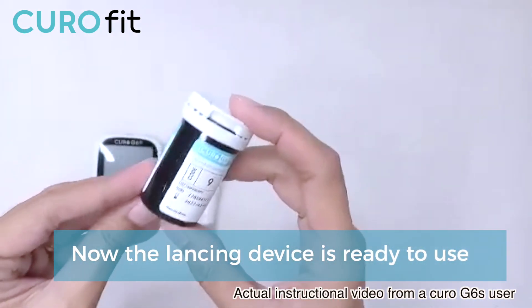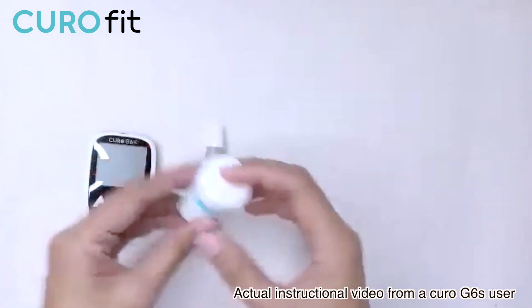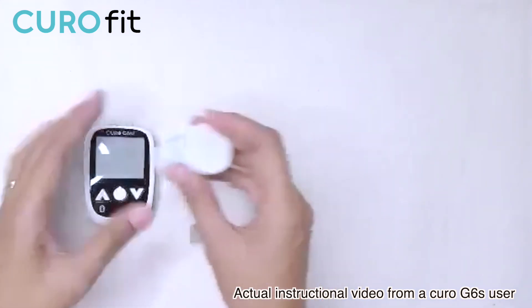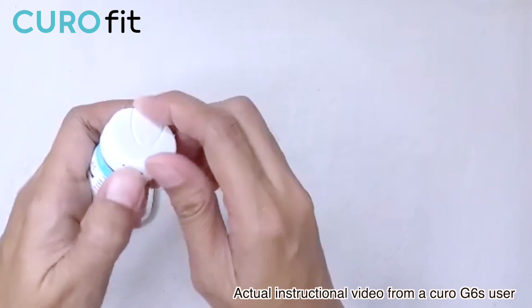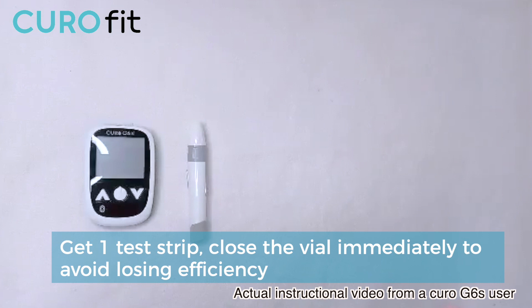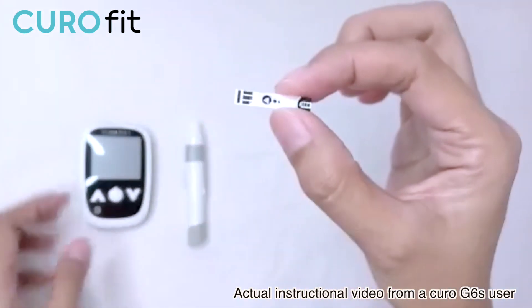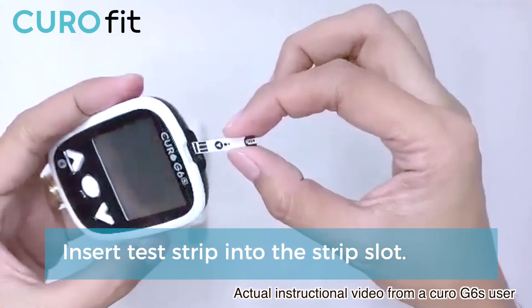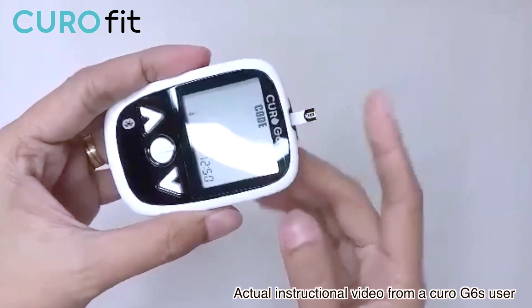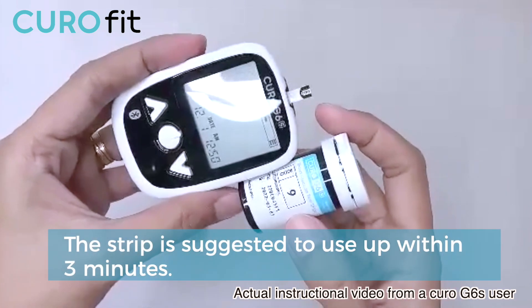The Kiro G6S automatically recognizes the test strip code number. Once we insert the test strip, it adjusts the meter accordingly. Insert the test strip into the meter test port in the direction of the arrow on the test strip. As you can see, there is a down arrow on the test strip — that is how we insert it on the meter. Once inserted, it will automatically turn on. The code shown is number 9, which matches the code on the bottle.